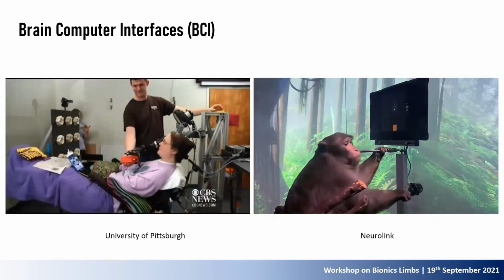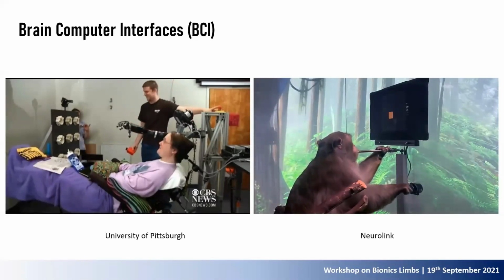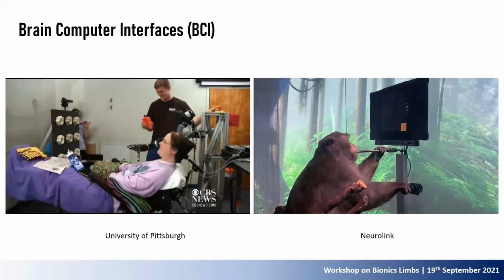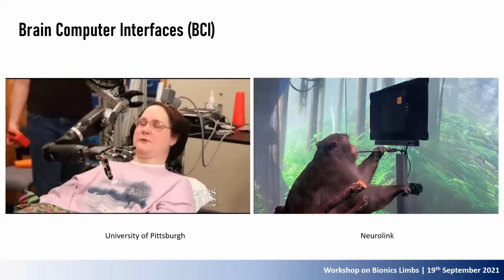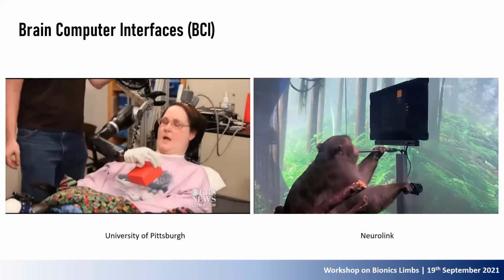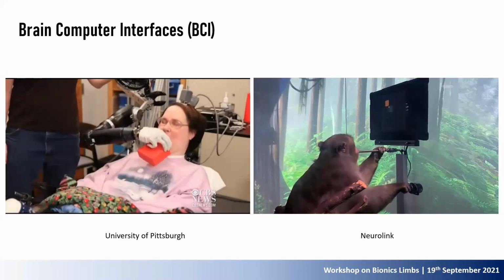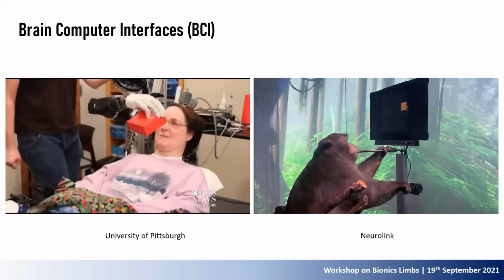The monkey is basically trying to play the game using neurons in the region that modulate their activity with intended movements of the limbs. For example, some neurons become more active when he moves his hand up, and others when he moves it to the right. The researchers record signals from many neurons using a wireless system, feeding their activity into a decoder algorithm that is able to predict intended movements in real time.